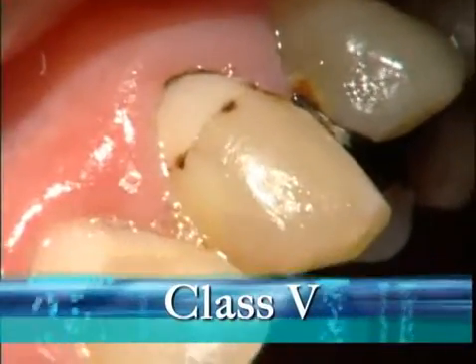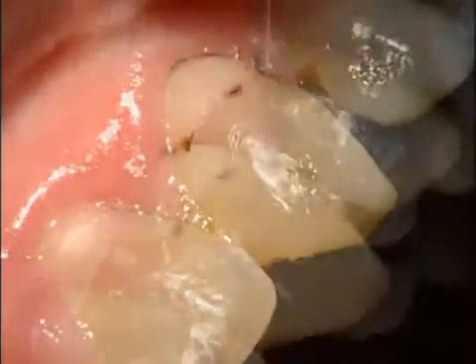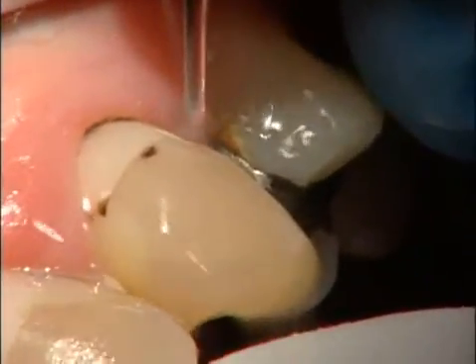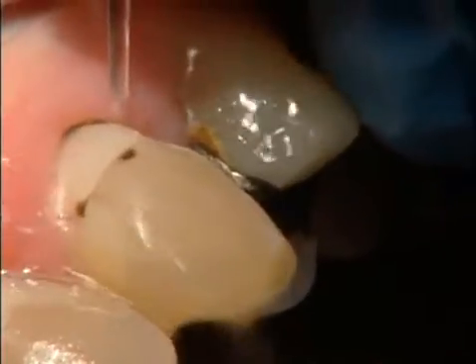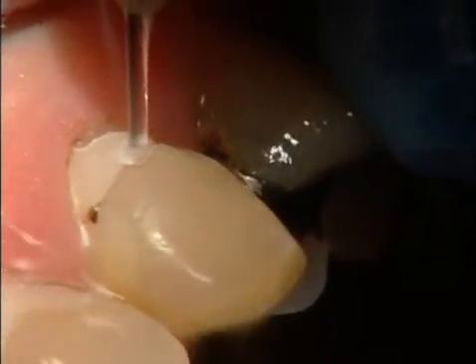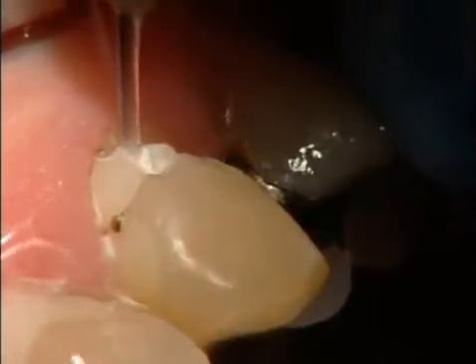So now we have an existing class 5 composite with recurrent decay next to an old amalgam. The problem with the amalgam is you need to stay parallel to it. If you get at all perpendicular to an existing amalgam, you'll cause a fracture of your sapphire tip. If the sapphire tip becomes fractured, then you lose your power. Hence, you've ruined your tip.